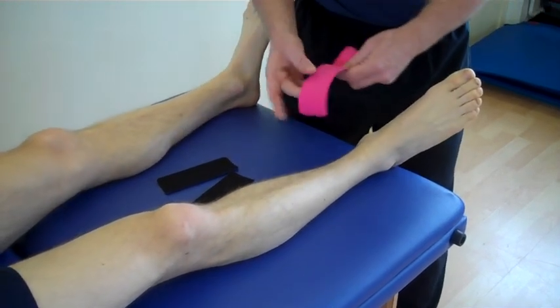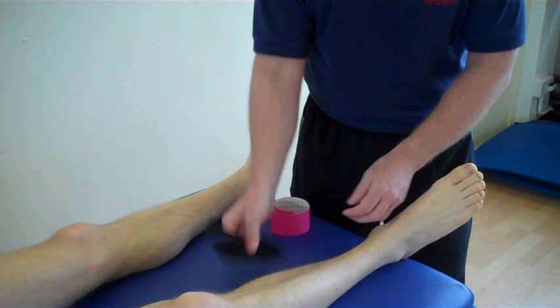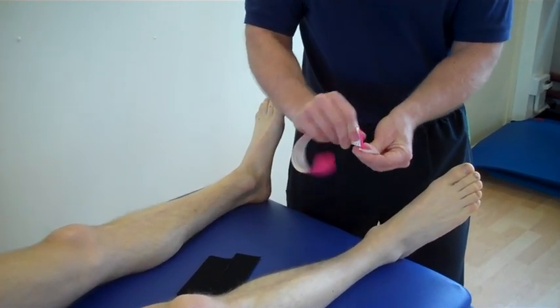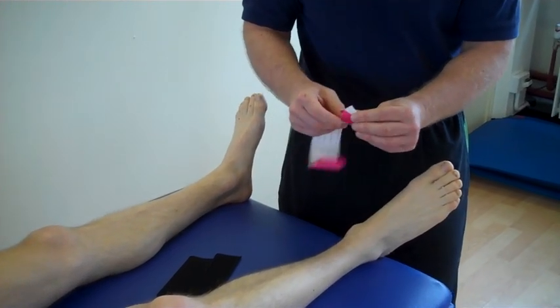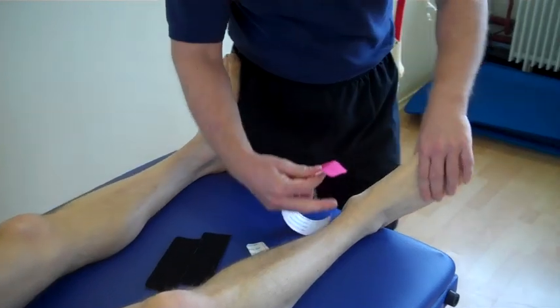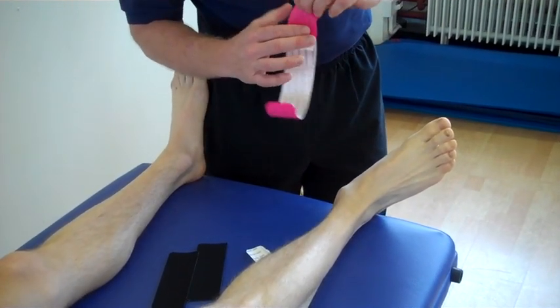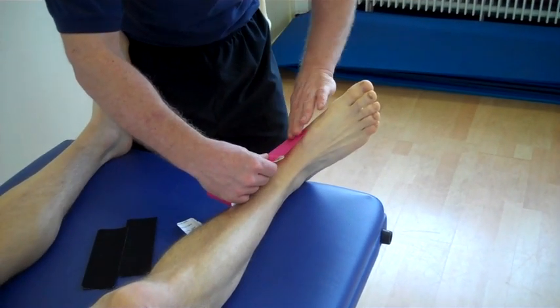Using the bits of tape, we've got a standard eye strip that's been pre-cut and again an eye strip split into two. Like most functional types of tape, we split the tape and there's no stretch on either end. We apply the tape so the foot is already in our position of stretch, so the tissue is on stretch, and then we apply the tape around the insertion with no stretch again applied.